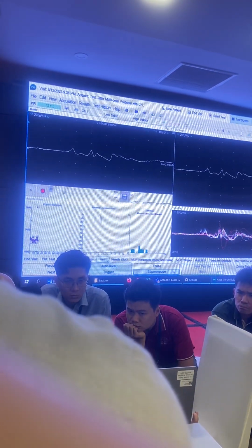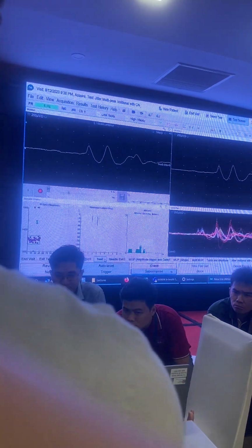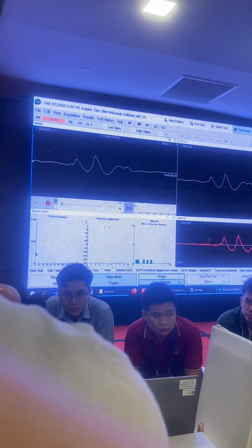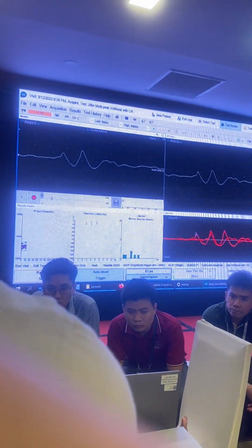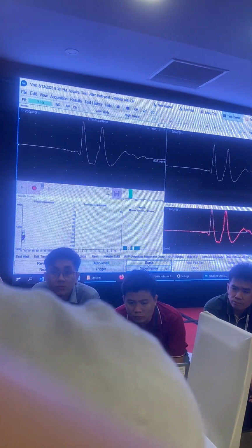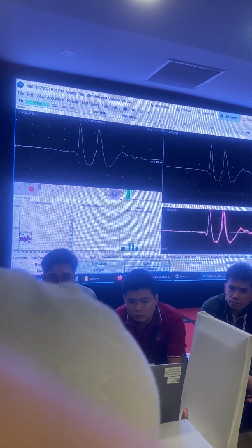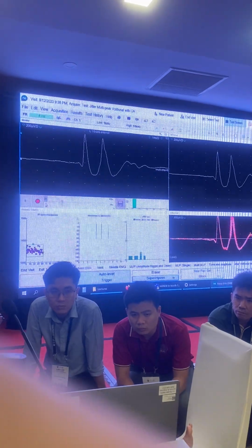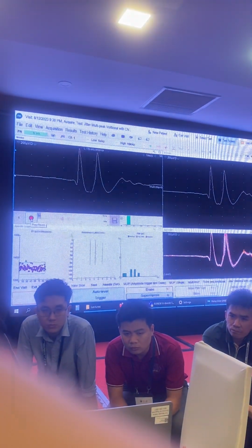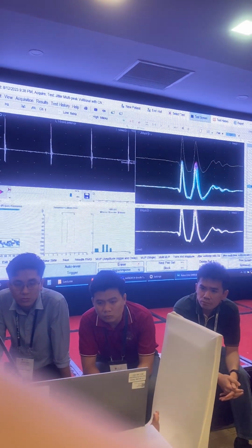I'm trying to get something complex. That's a good recording. So I accept it. And again, this is something that is not good.